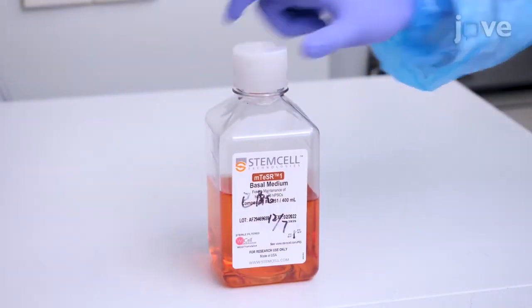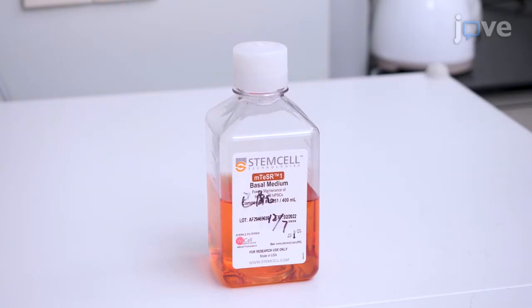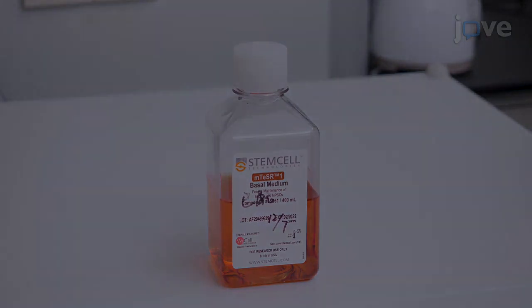Prepare hPSC maintenance medium according to the manufacturer's instructions and pre-warm it to room temperature for 30 minutes.